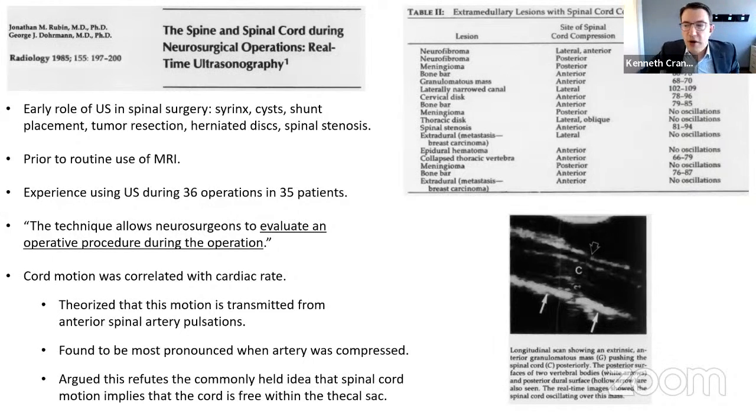Yeah, I'll add to that too. I think that both are important, because neuromonitoring tells you more than just what's going on at the exact area where you're doing the surgery, which is really all ultrasound can see. It can't tell you what's going on elsewhere. So neuromonitoring can also detect issues with patient positioning, et cetera. The other thing is, if you stretch a nerve root, you're not going to see that on an ultrasound. Or if you slip and accidentally hit the spinal cord and then get a neuromonitoring change, the ultrasound is still not going to show anything. So it's an adjunct, an additional thing.